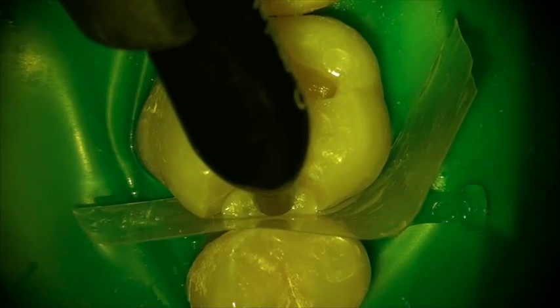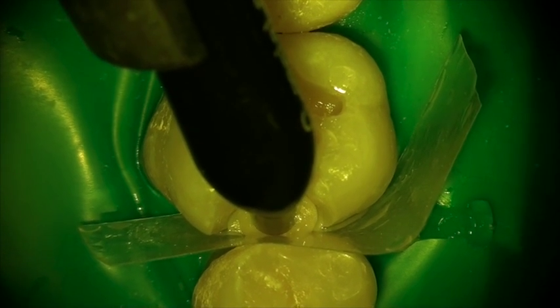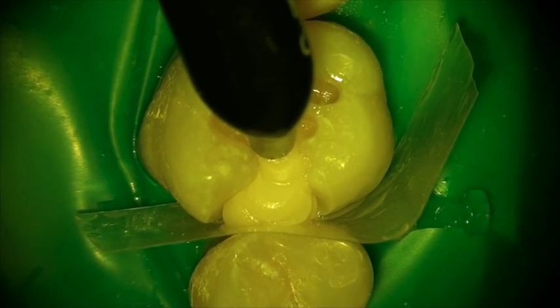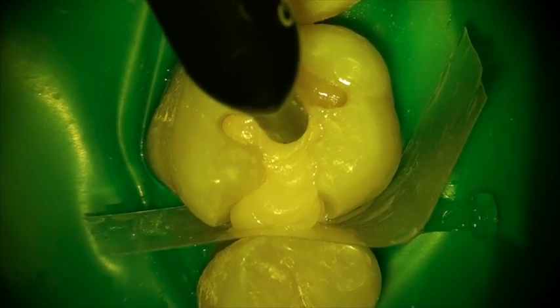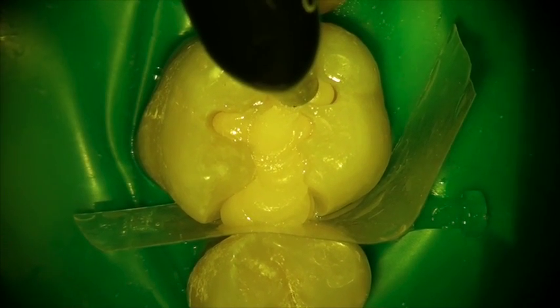We're next going to apply Genial Sculpt. You are going to love the characteristics of this material. It is highly aesthetic, it is incredibly sculptable, and what's great is it is self-polishing. Over time, this material actually looks better.